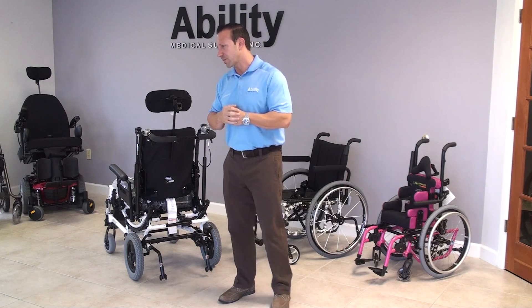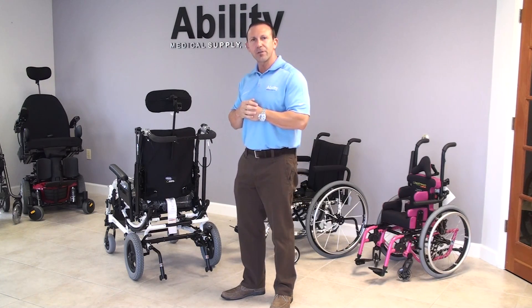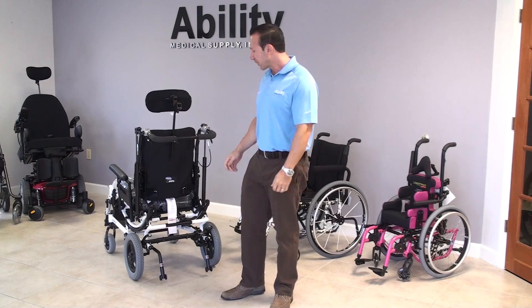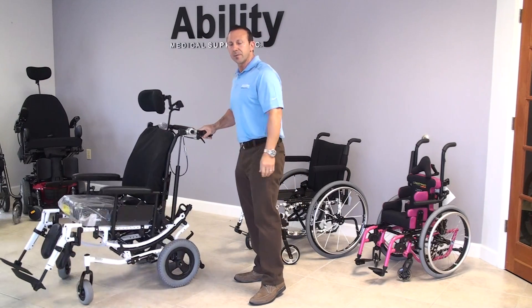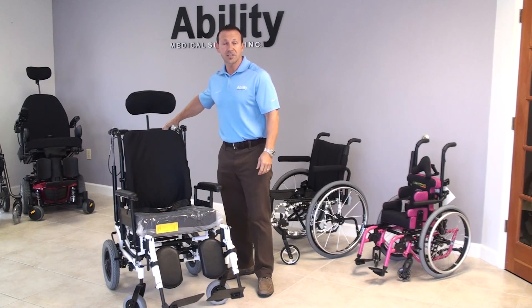Today we have what's called an Invacare Solara 3G — third generation tilt-in-space manual wheelchair. A chair like this is designed for someone who is totally dependent, that has very low function and very low cognition.